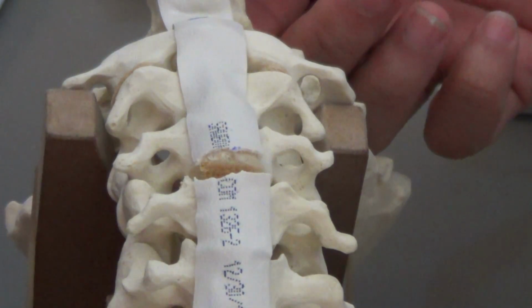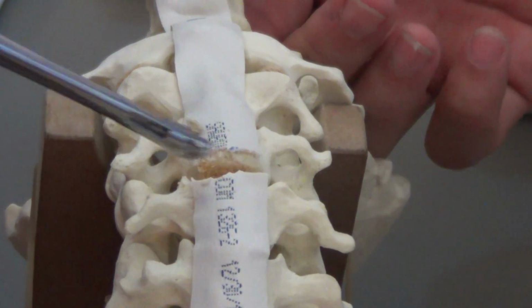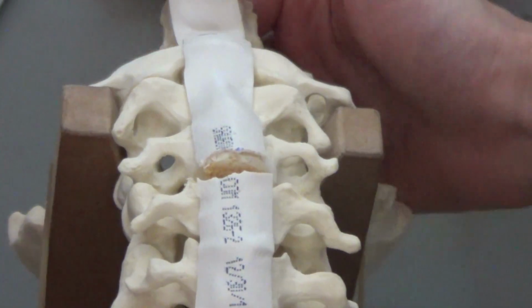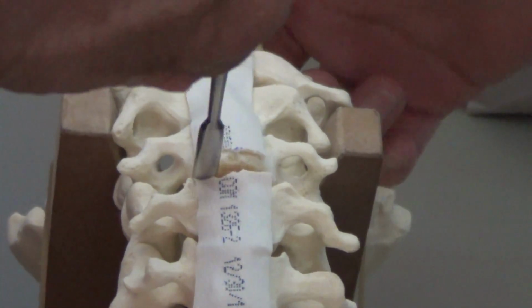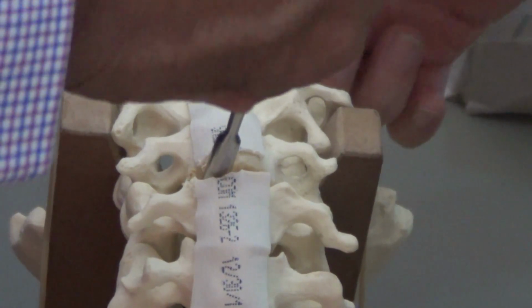Before I come to the posterior longitudinal ligament, after taking off the disc, I use a burr and also burr the cartilaginous end plates, till you find the cortical bone superiorly and inferiorly. And this must also be straight.